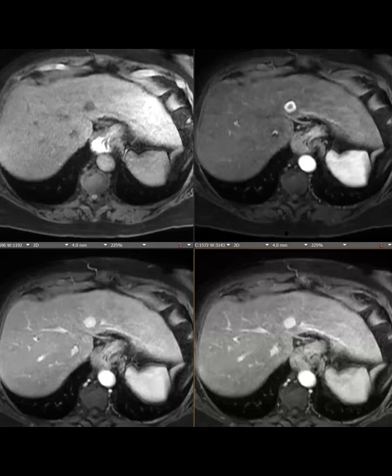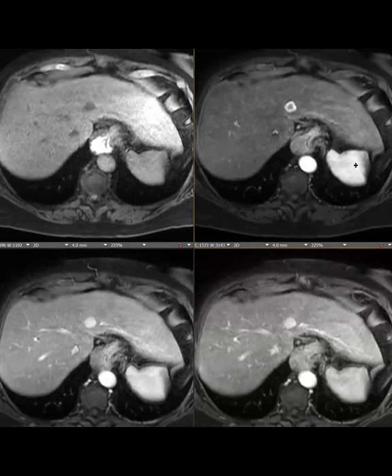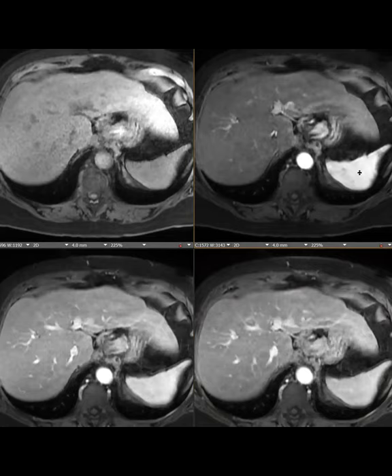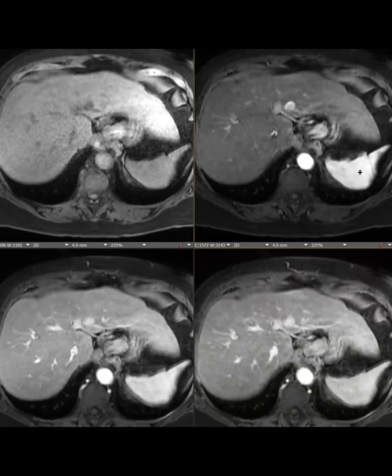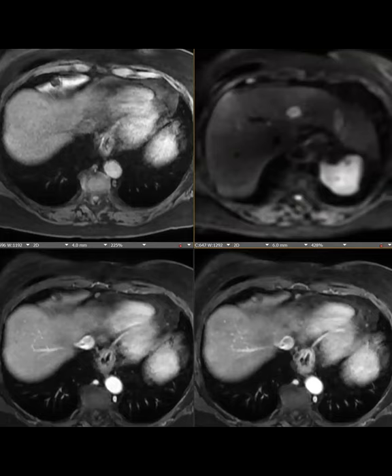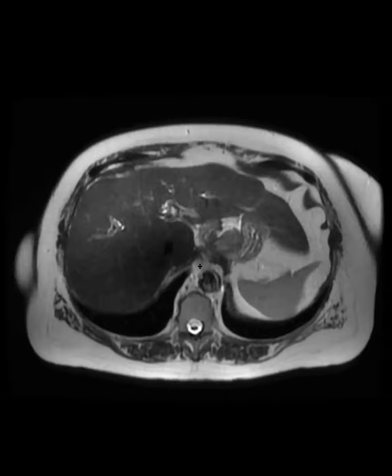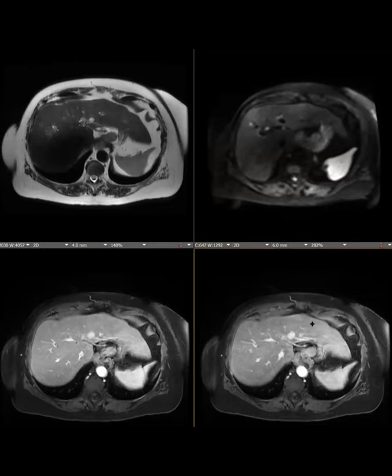Okay. So this is a patient's, what do you guys think? Liver transplant evaluation. This background liver looks cirrhotic. And we have an arterial enhancing lesion that has rim enhancement with fill-in. T2, let me get it for you. And DWI would be helpful. Okay. So here's the DWI. Looks like it's restricting. And then the T2 is right here. It's very bright. That's hemangioma bright. Maybe it's a goofy hemangioma. No, wait, hold on. Sorry. It's not a hemangioma.